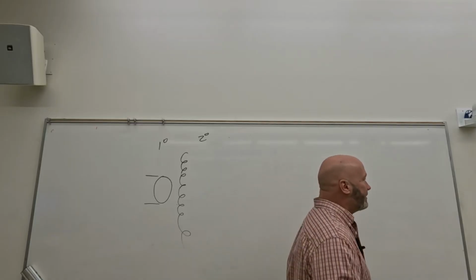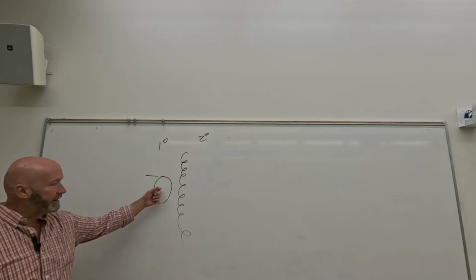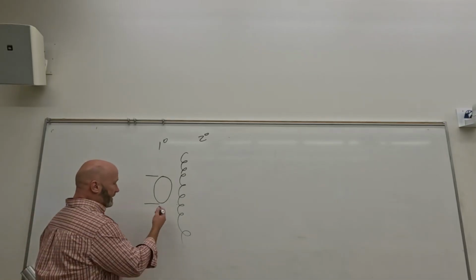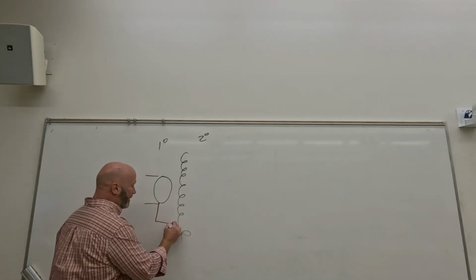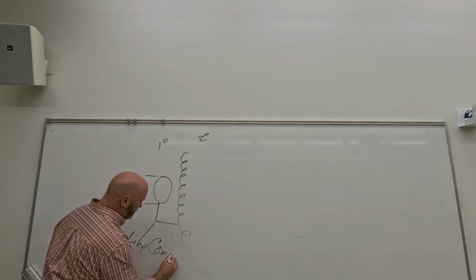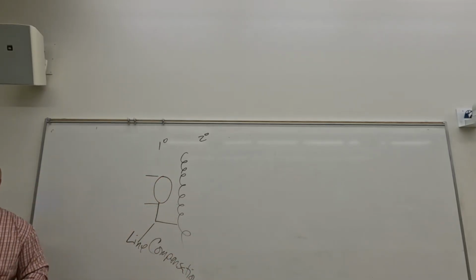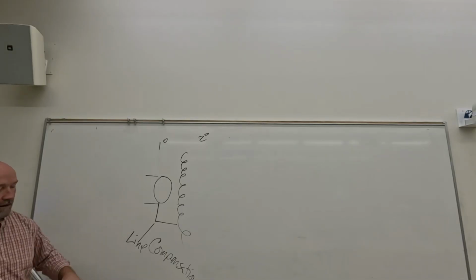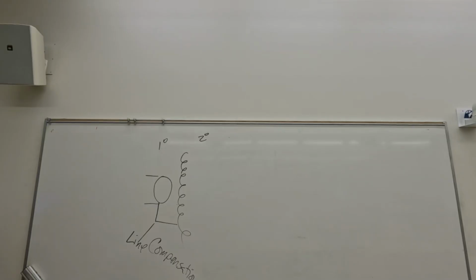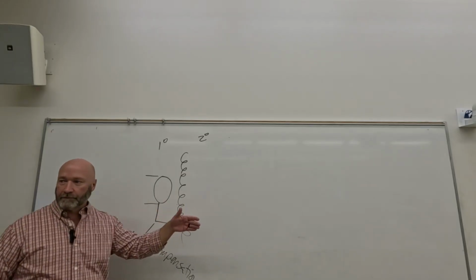So what we have to have is a set electricity that's coming into the system, and that's what that thing tells us. Now that goes into what we refer to as the line compensation circuit. Really, the line compensation circuit is the first thing that the electricity gets to. The purpose for line compensation is to set our electricity so that we know what we have going into our auto transformer.